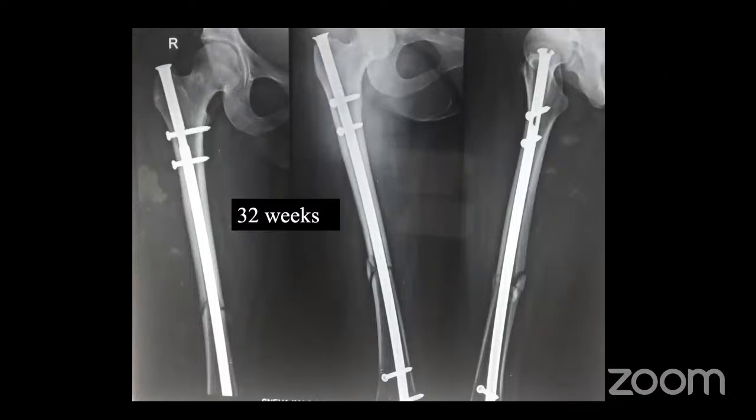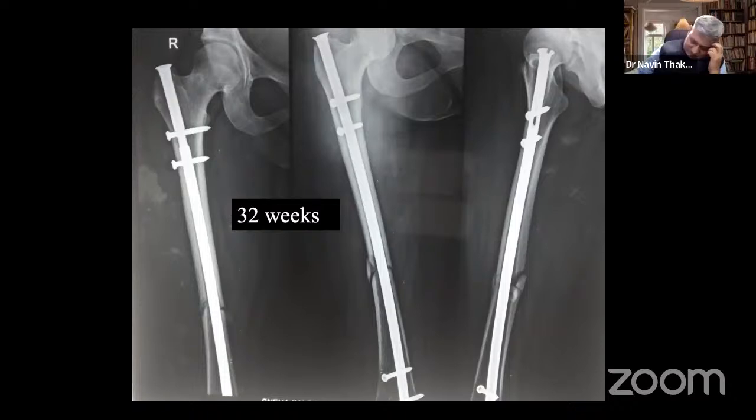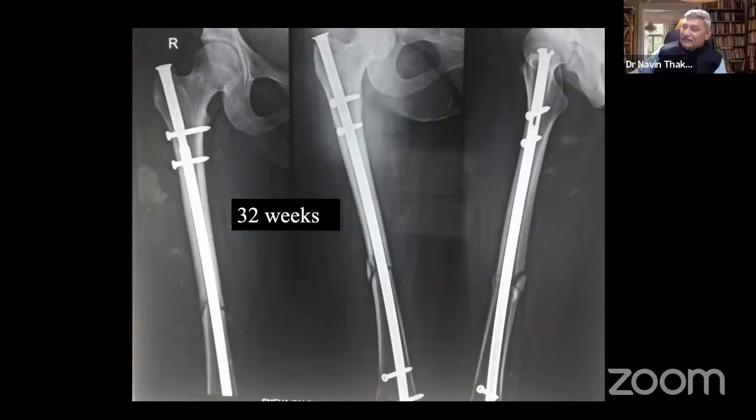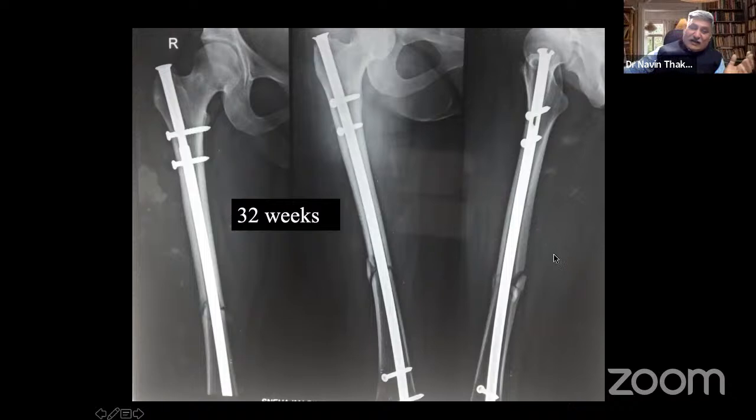No, dynamization will help. I think now here is the problem. Yes, sir. I think this would proceed to auto dynamization and then healing. So auto dynamization is a possibility of breaking the screws by nature. You said. Yeah, because I think there is a good alignment here, good contact here. Yes, so almost this, good contact. This may heal, but it is taking longer time.